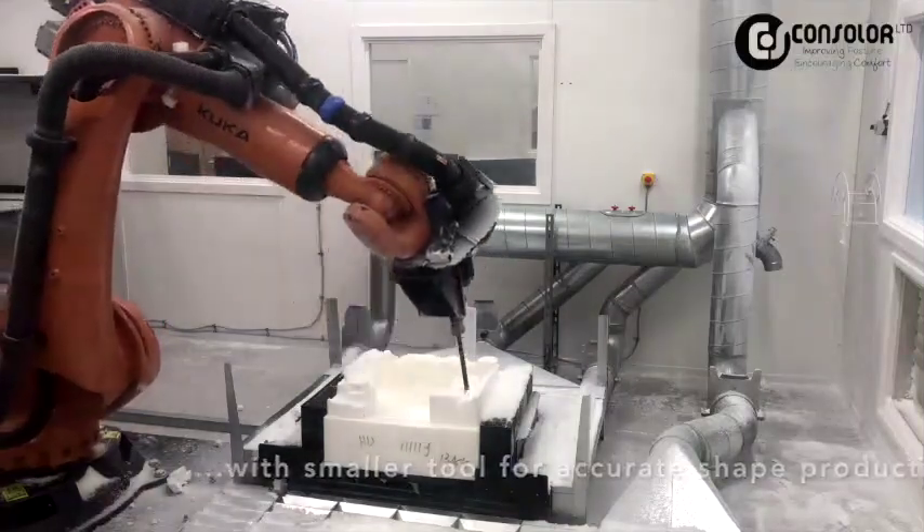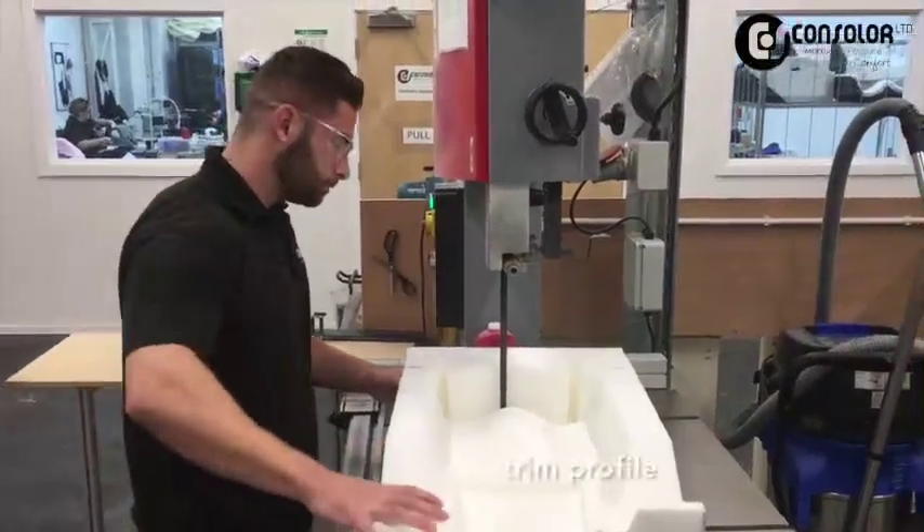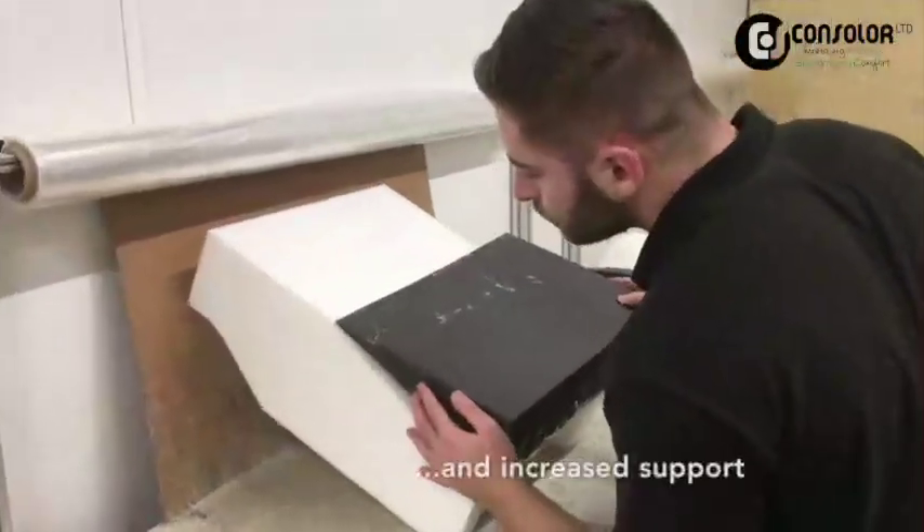This has been proved to be over 99.6% accurate. And the Consolor process means it is easy, accurate and repeatable when aligning the back and base cushions at the set-up stage.